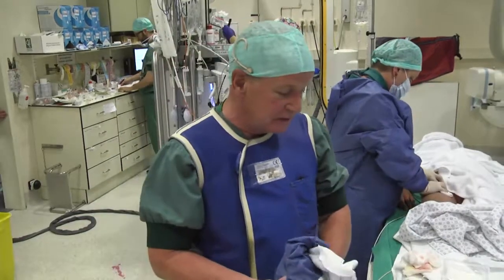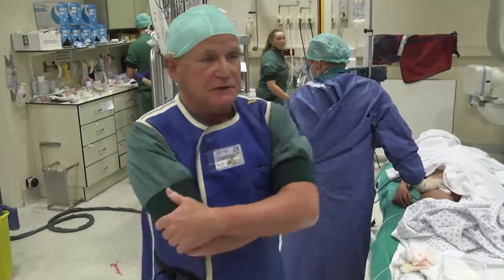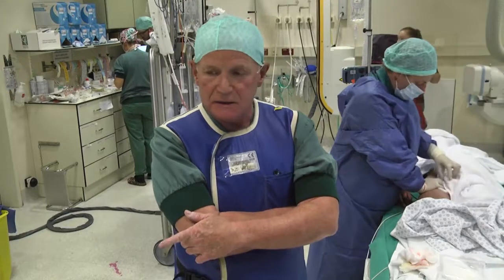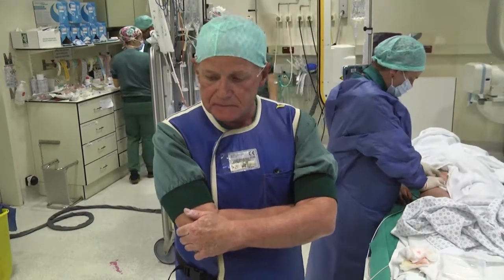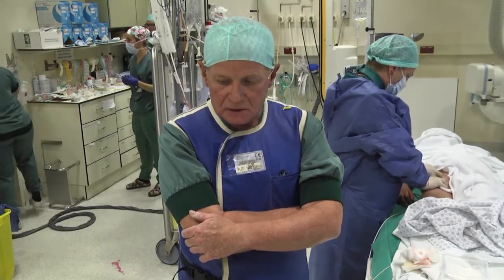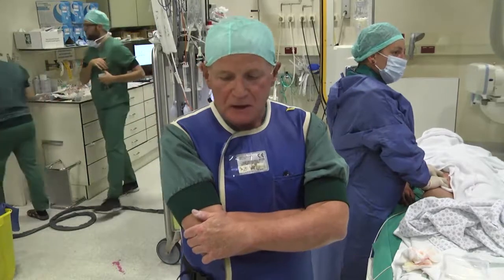So there was nothing to check in the old days. And Mark, in this case in particular, this shows the importance of the marker. When the stent moved, if there were no markers, I'm sure you would probably have detected that, but it would have been harder.